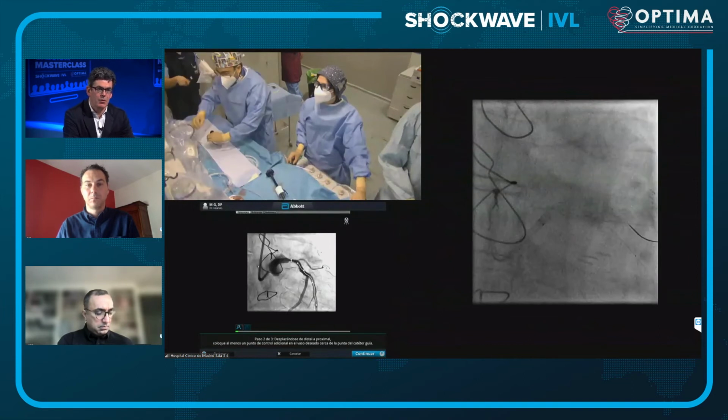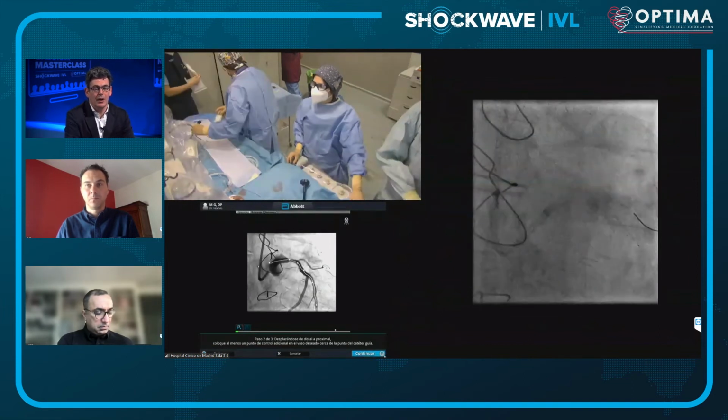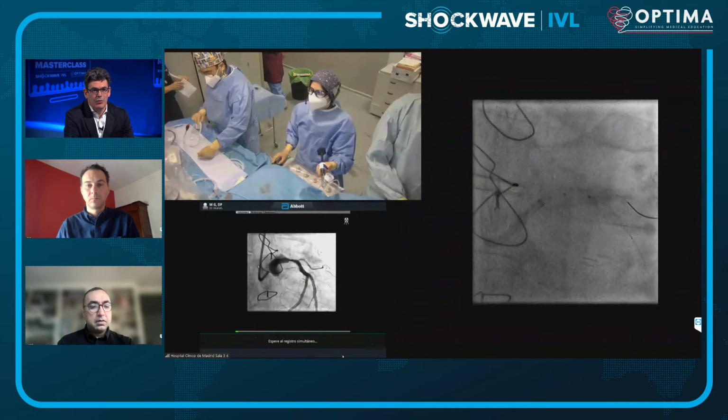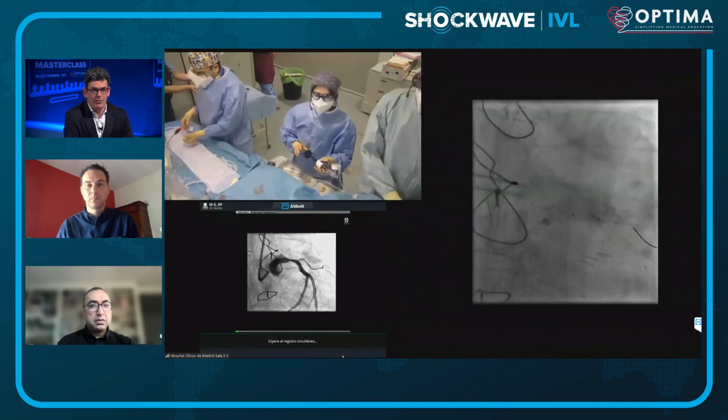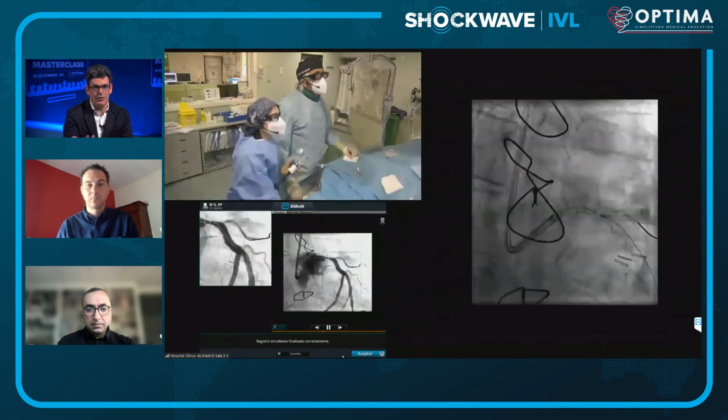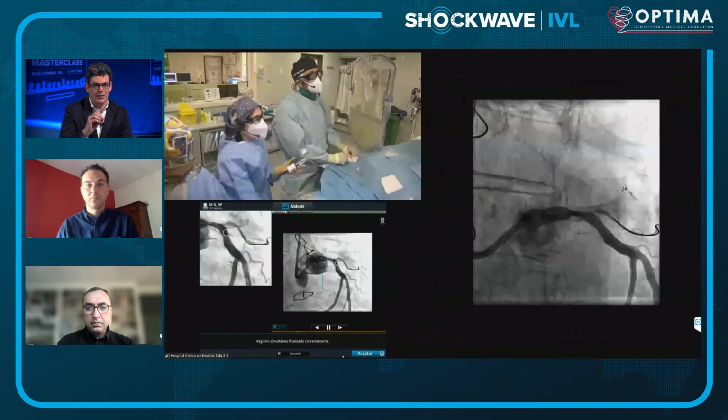But if you were to look at your algorithm, going back to the algorithm you presented in this masterclass, if you work your way through the algorithm and intravascular imaging following your first stage of calcium modification, then this would have fed back and the answer would have been to use IVL again.